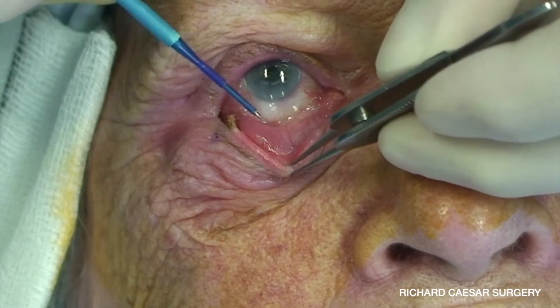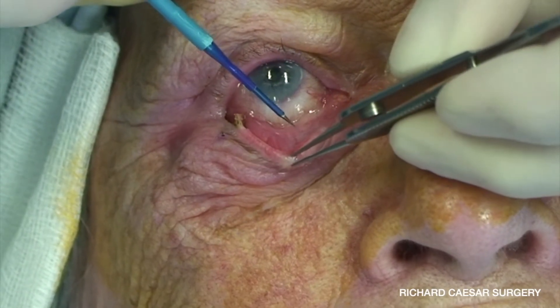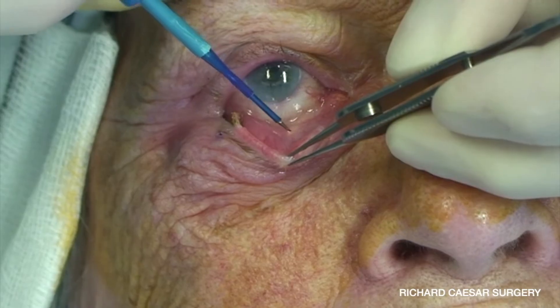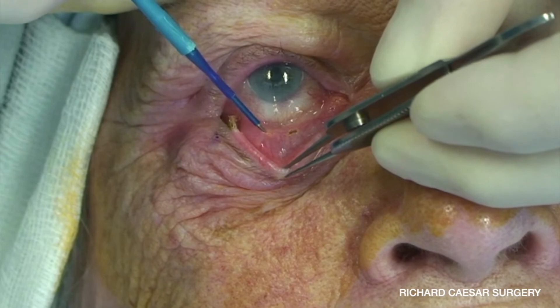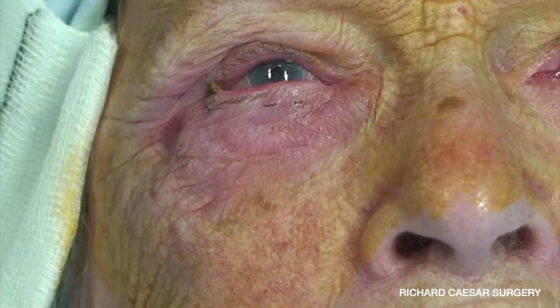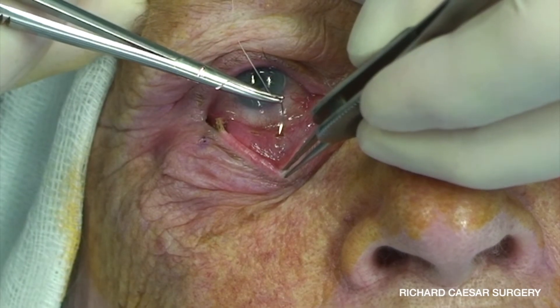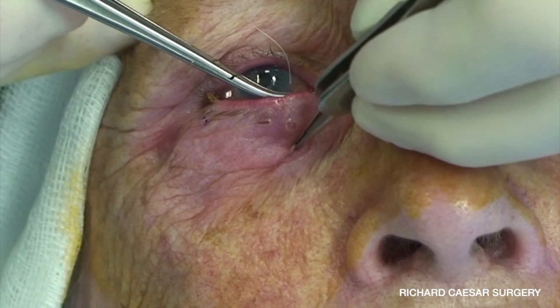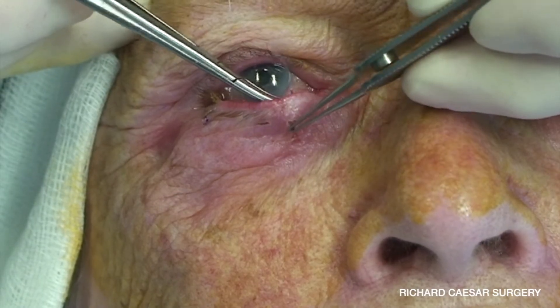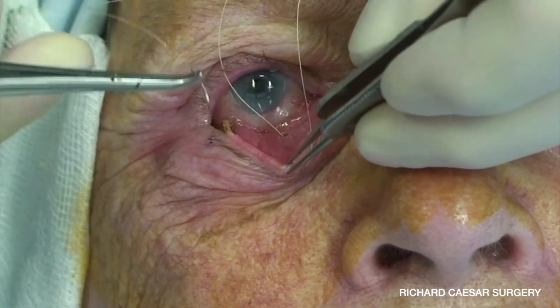Because the lid is now released, you can evert and you can see the line of the lower lid retractors — this is visible as a little change in coloration — and you make two very simple stab incisions at that point. This technique is really very simple. The 5-0 double-armed vicryl is passed directly as an everting suture, but because of the two little stab incisions it becomes a buried everting suture.